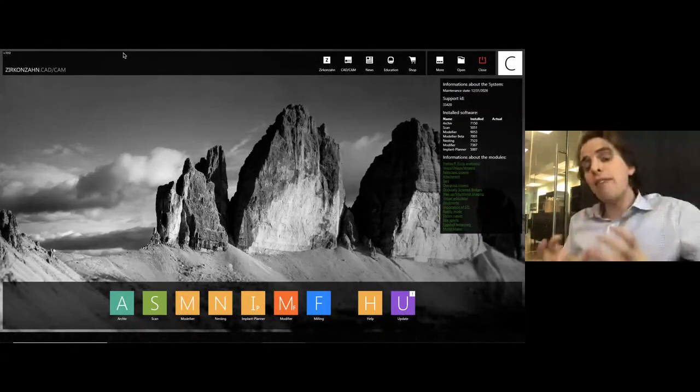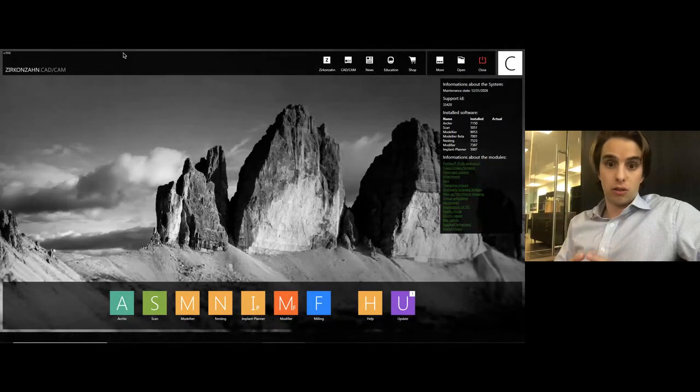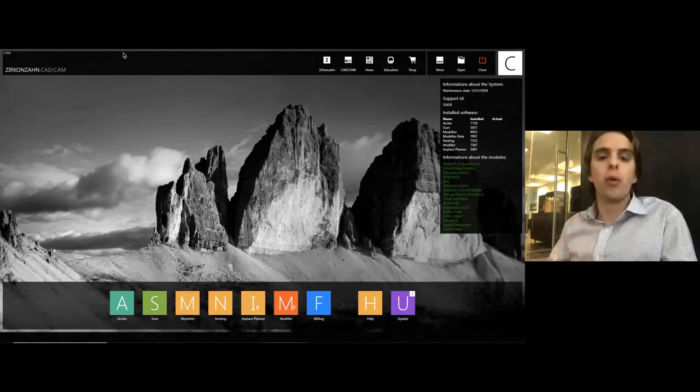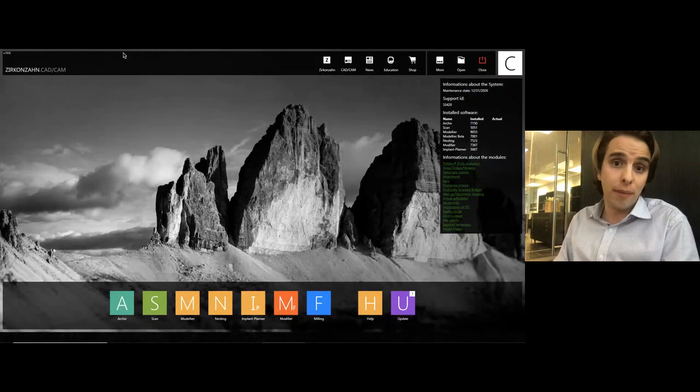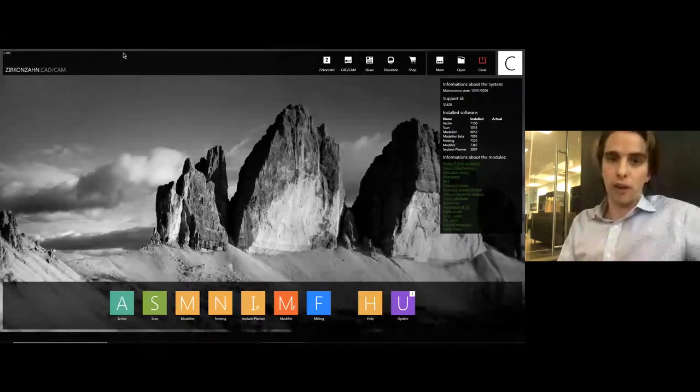And once we have the prescription inside of a lab pan, we take this, in the conventional world, to the plaster room where we will pour our models and establish these models on an articulator. And in the digital world, we're doing the exact same thing, except this happens in the Zirkonzahn scan software.